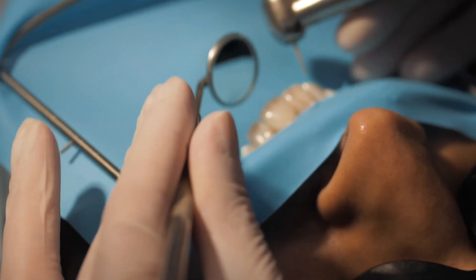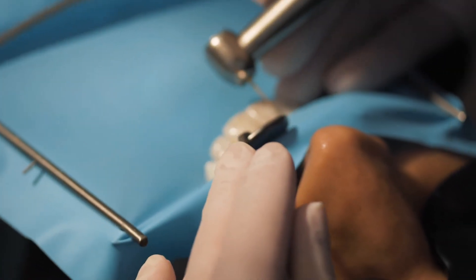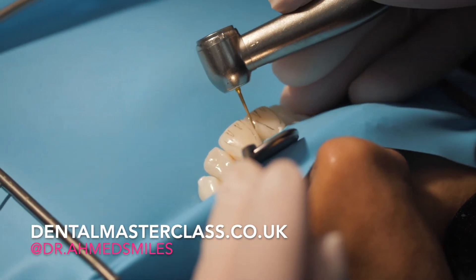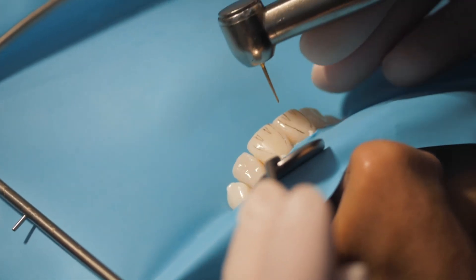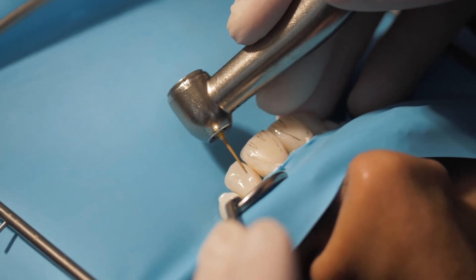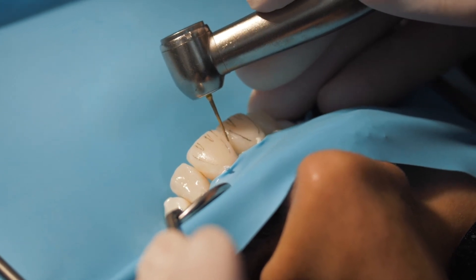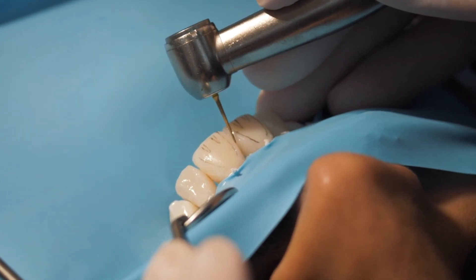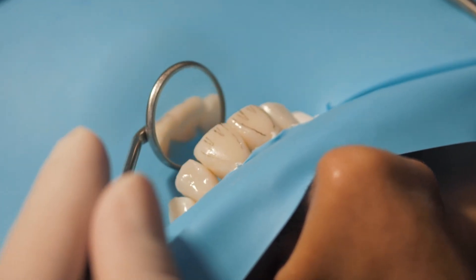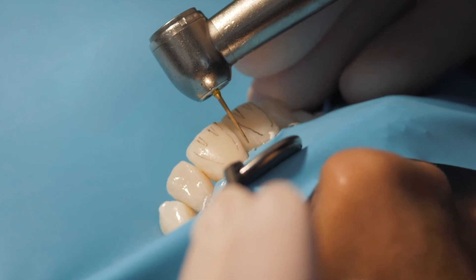I'm going to go over with a fine diamond burr to ensure I've got the three facial planes and just to even out any junctions between the material — like these ledges here, the junction between this wall and the labial. I'll use a spoon and then do the rest with a disc. It's just a bit quicker using the burr first. We can do this without water — let's see how it goes.